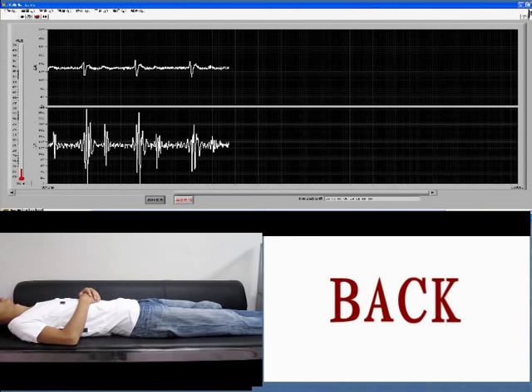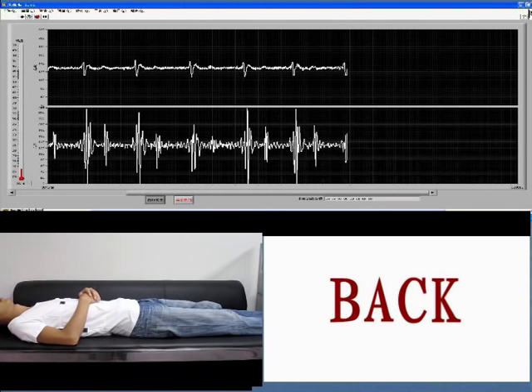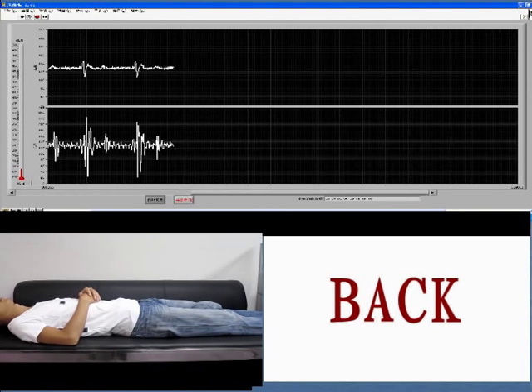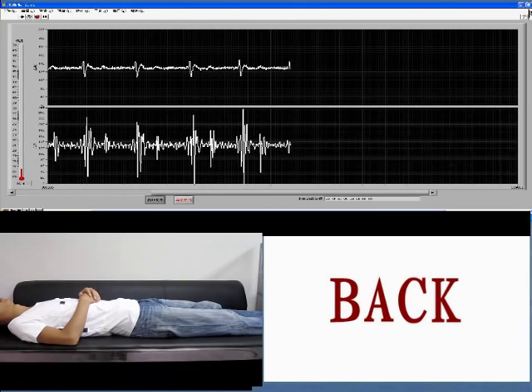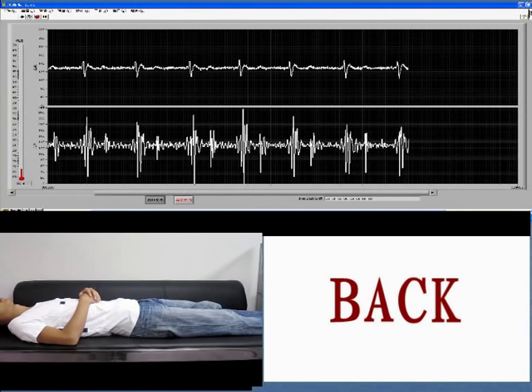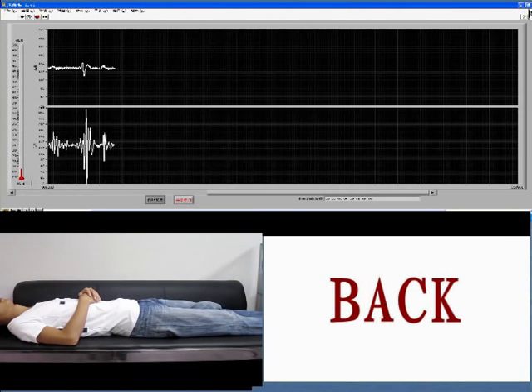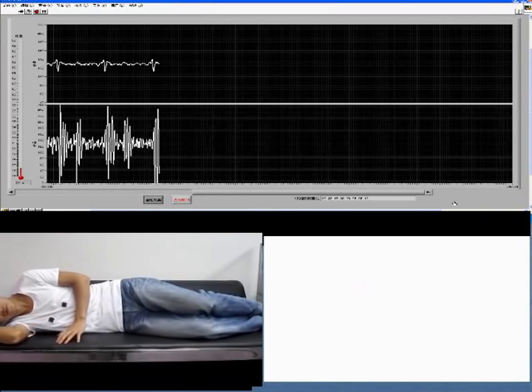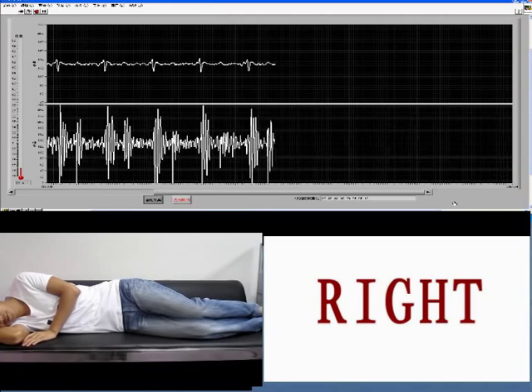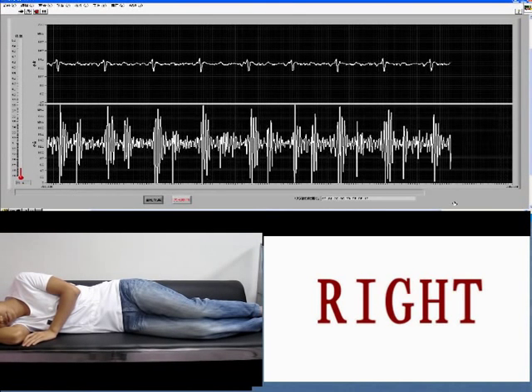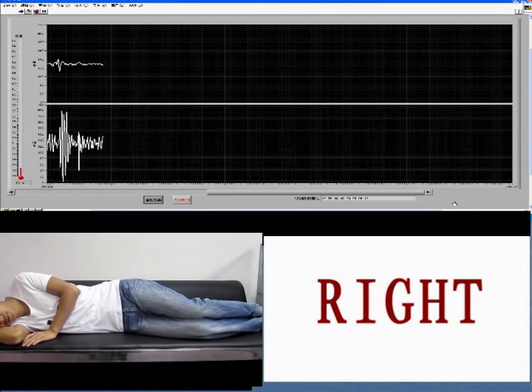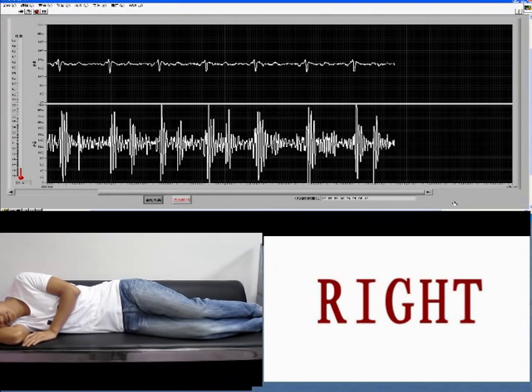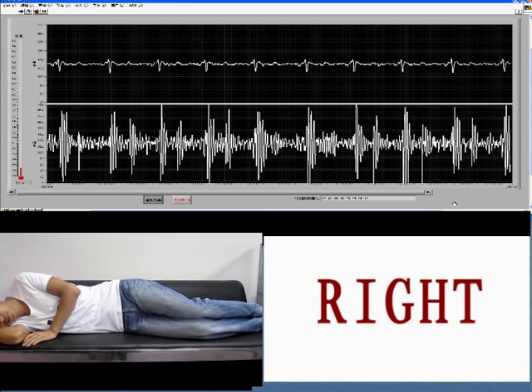Now we observe the heart sound and the QRS complex at the same time. The S1 and S2 heart sounds can be identified clearly. When the subject is lying on his right, both amplitudes are small, but it is still enough to identify his heartbeat.